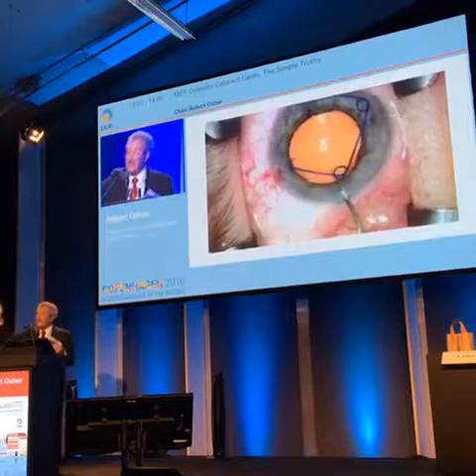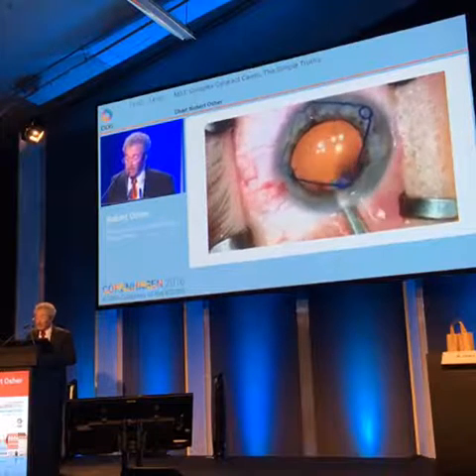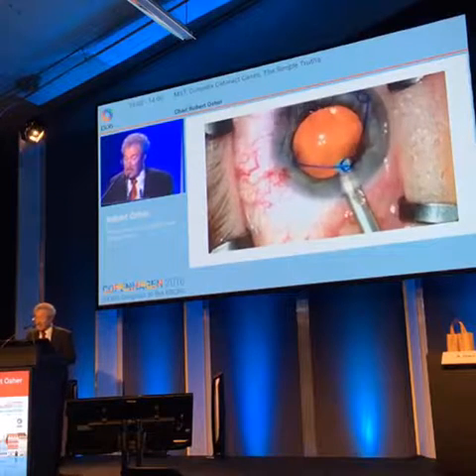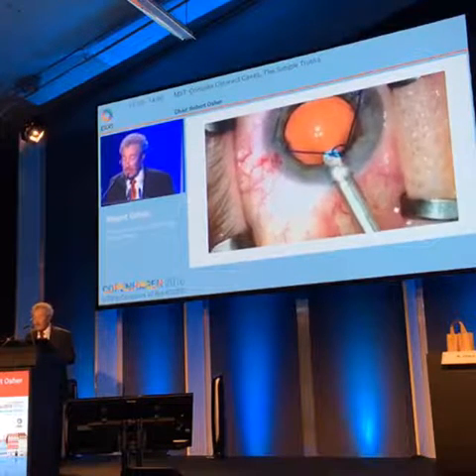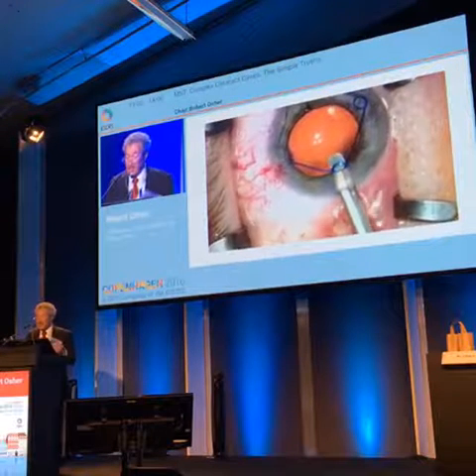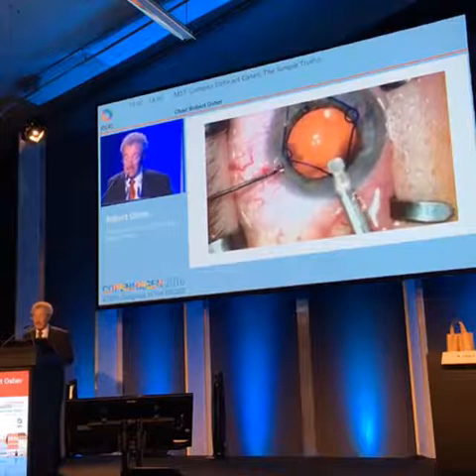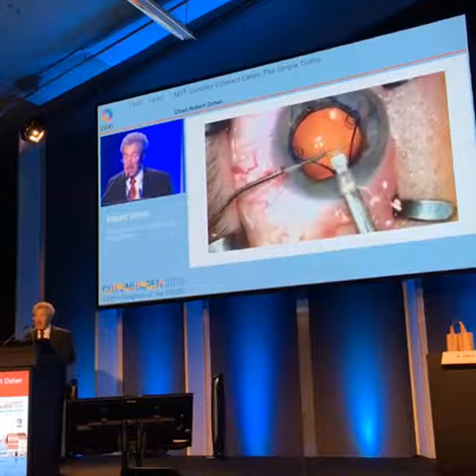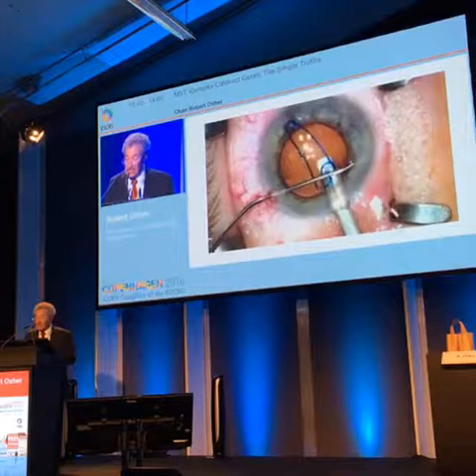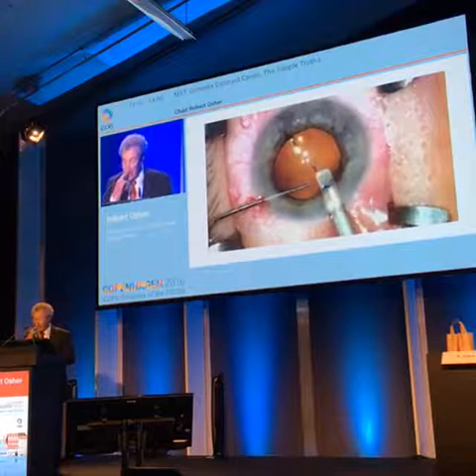And that freezes it where it will be very easy to go underneath the scroll with the platform, bring out the little tiny finger, which I love, engage the scroll, and then I'll put a second instrument in, and I'll simply help these two rings, because see, it does get hung up sometimes. So I press it down, and it's very, very atraumatic.